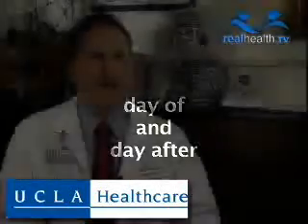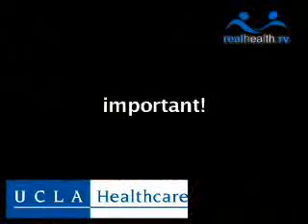So one of the very common side effects Elizabeth actually alluded to when she mentioned she had that sandy feeling in her eye. Pretty much everyone has more dryness in their eye after LASIK. That typically lasts on the order of 3 to 6 months. It's more common in women, especially postmenopausal women, and can persist for up to a year. And Elizabeth mentions actually in the video that it took about a year for her eyes to get back to normal. I think she's referring to that dryness issue, that she had some sensation of dryness out to 1 year, which is not that uncommon.